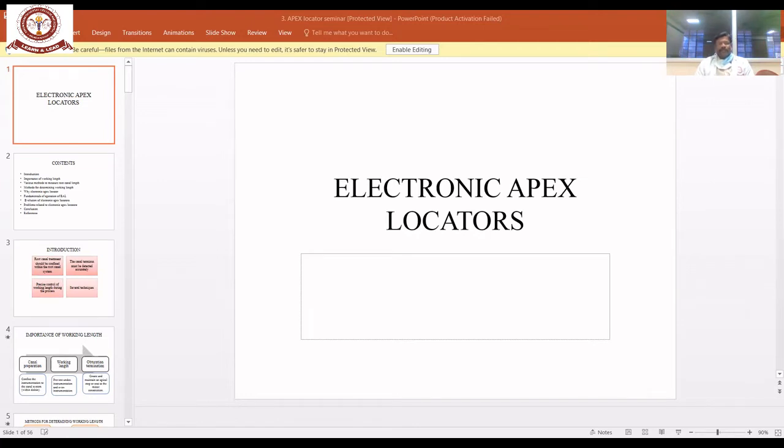So in this picture, you can see the major apical foramen and the minor foramen. A represents the major apical foramen and B represents the minor apical foramen. The shape of this apical portion is an inverted cone with the base located at the major apical foramen and the apex of the cone located at the minor foramen. This structure coincides with the apical constriction, regarded as being at or near the cemento-dentinal junction as per Cutler. This structure produces an hourglass shape.